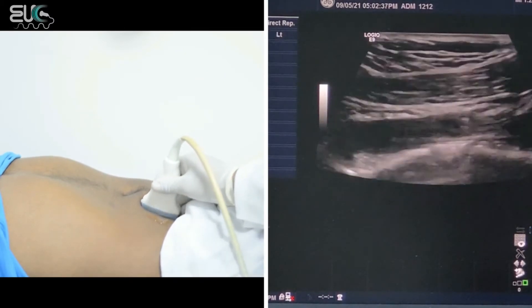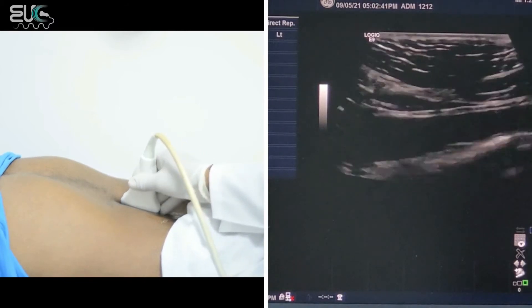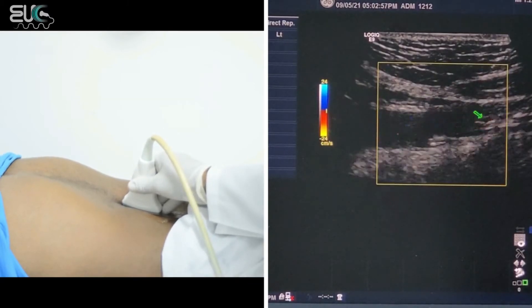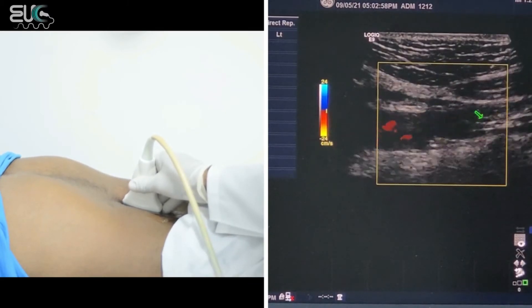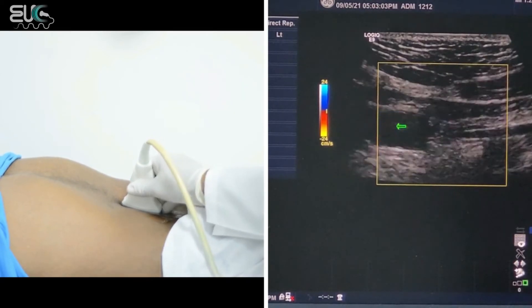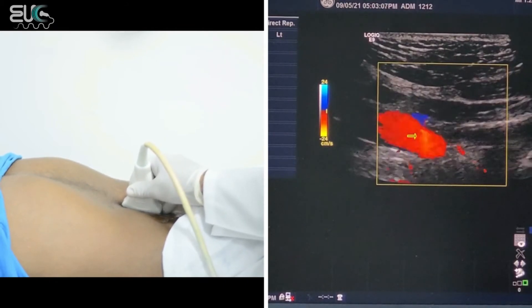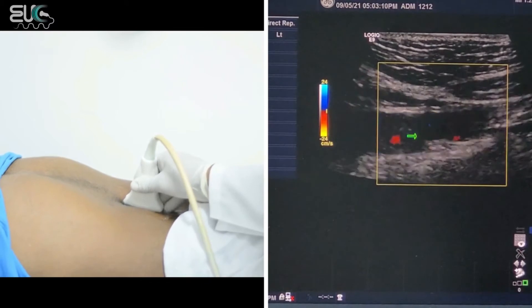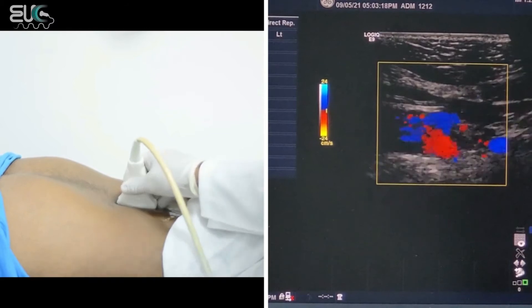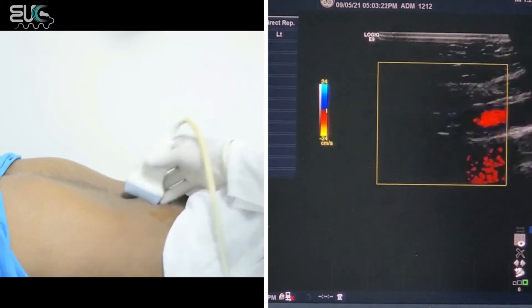I will follow the common iliac artery up going toward the aorta. Here we have the right common iliac artery, and here we have the aorta — we can see the change in diameter. Even as I angle the probe, we can see the left common iliac artery originating here. Now I am over the aorta, and I also have to take the velocity for the abdominal aorta.